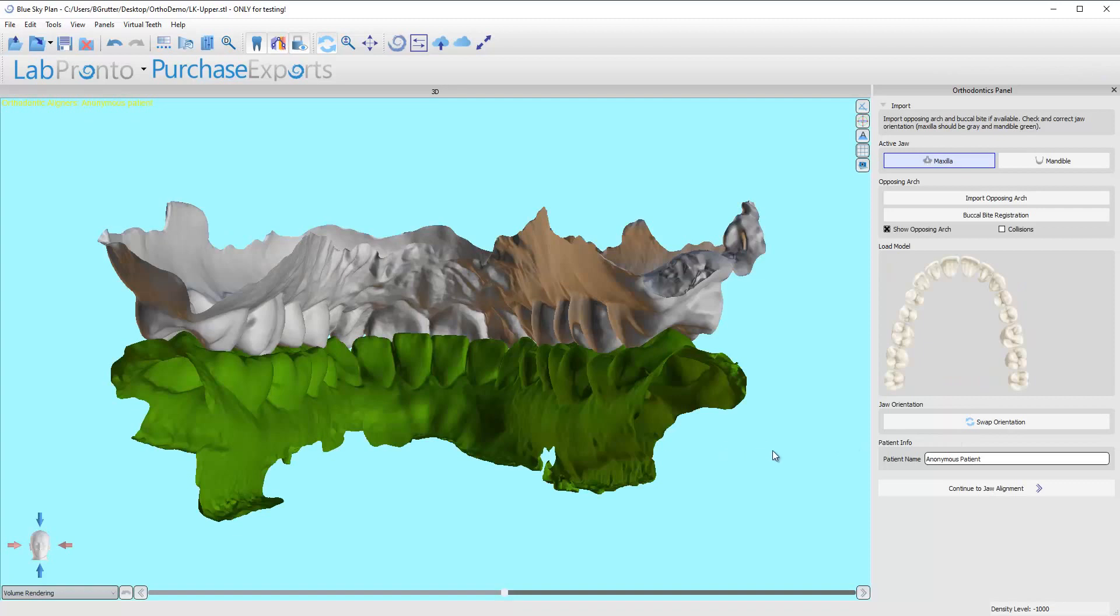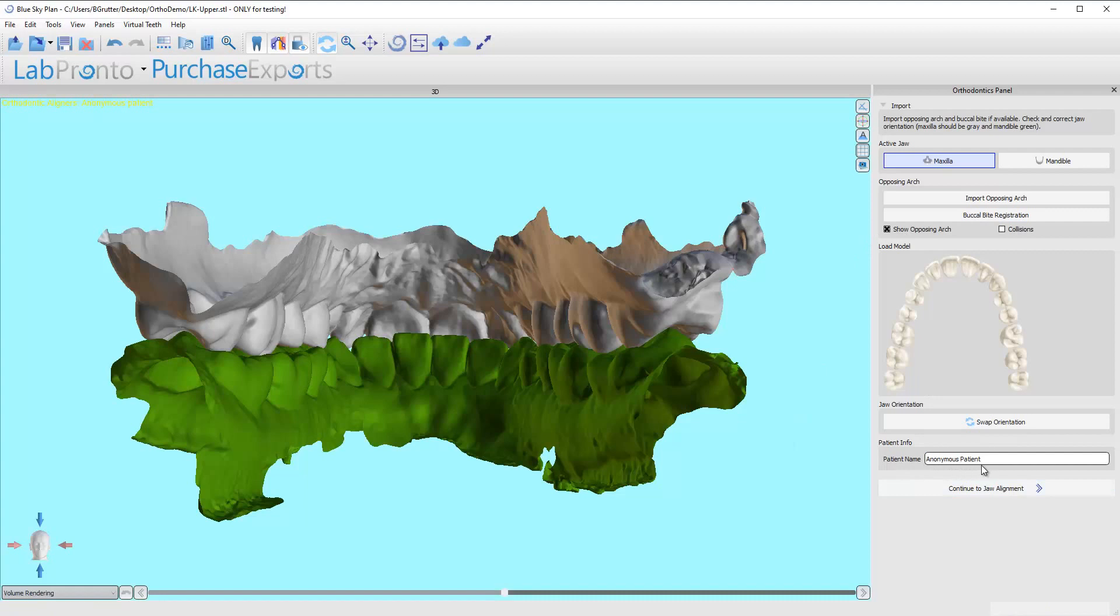And now I can go ahead and get my case started and all I'm going to do is name the patient. We're going to call this Jane Doe and that's it.